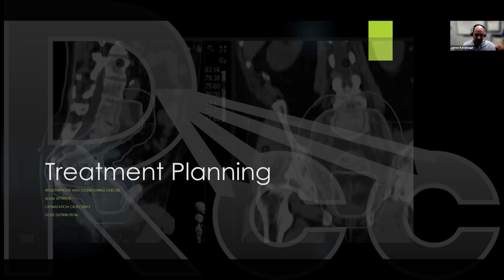And then you get into the logistics of how do you get reasonably reproducibly full bladders. When it's really important, we actually have preset guidelines of, basically a certain amount of time before. I think we've settled on about 2 hours before, empty your bladder, and then an hour and a half before, drink 8 ounces of fluid. And so we're reducing that fill rate, and we're getting close to the amount of fluid that we want for treatment. And we do that for SIM and treatment. So those are for our prostate SBRTs, those are for our prostate bed SBRTs, where the bladder filling is really, really quite important. Even with that, we see variation. It's just limiting the variation.